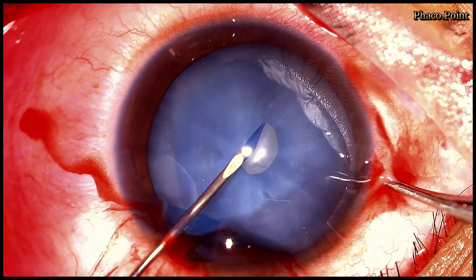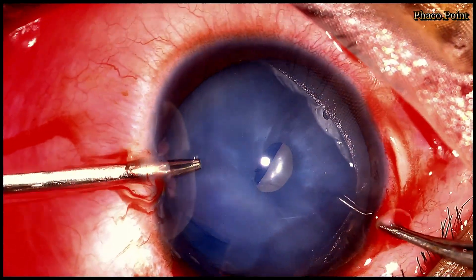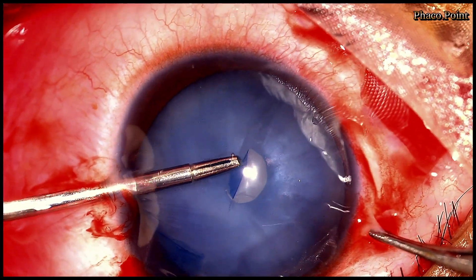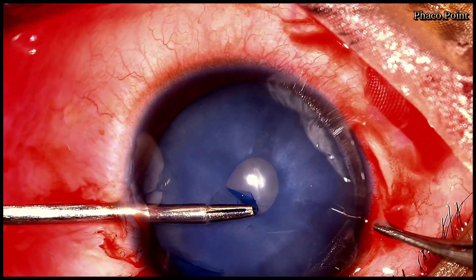Having progressed a little further, with the help of intraocular forceps, I now proceed to complete this half opening into a tiny circular rhexis.